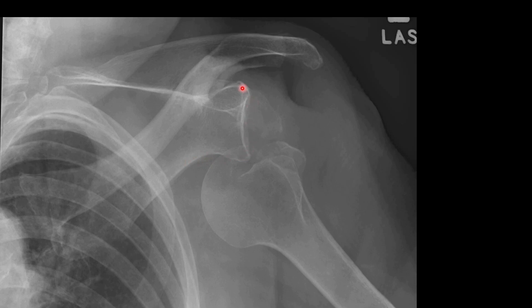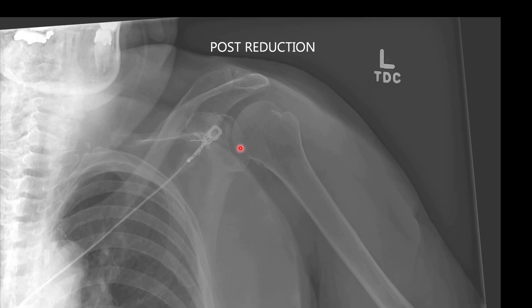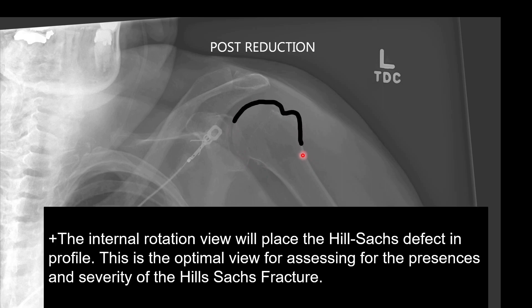In this case, we have another anterior dislocation with the glenoid here and the humeral head. If we follow the contours of the humeral head, we can see this displaced fracture. I've gone ahead and drawn out those lines for you. Post-reduction films such as this one can be useful in the detection of the Hill-Sachs defect. The internal rotation view is going to be the view that we want to use when searching for a Hill-Sachs defect.